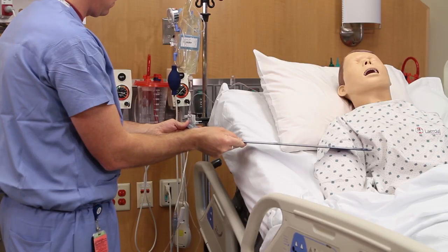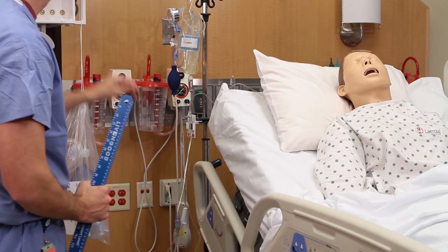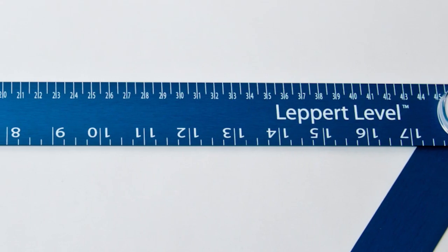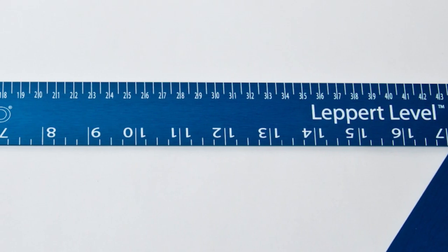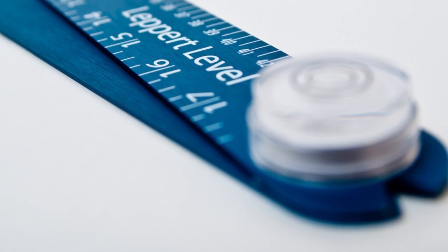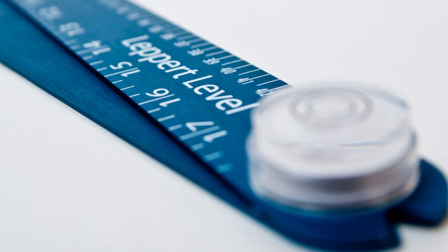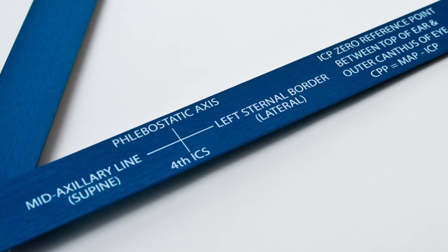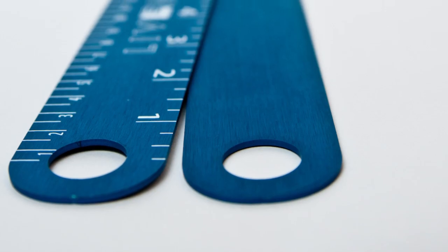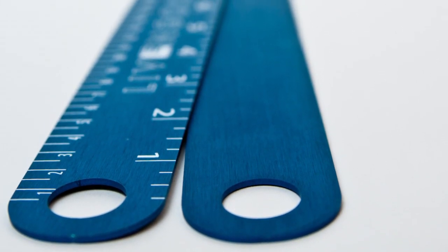The Leppert Level was designed by an ICU nurse for easy use and to be a multifunctional tool valued at the bedside. Ruler markings allow for on-the-spot measurements of pressure sores, wounds, etc. A protractor at the pivot point allows for measuring elevation of head of bed and range of motion measurements of extremities. Reference material for the caregiver including the anatomic landmarks and the Glasgow Coma Scale. Large ring holes to adapt to most any IV pole for easy storage between uses.